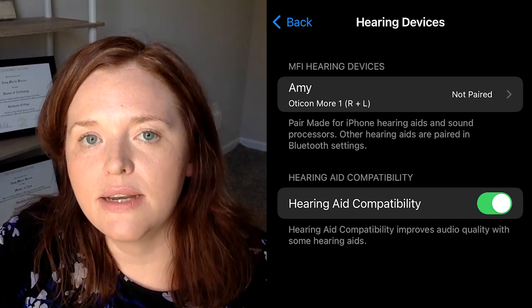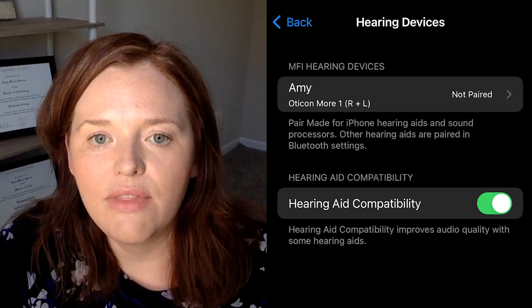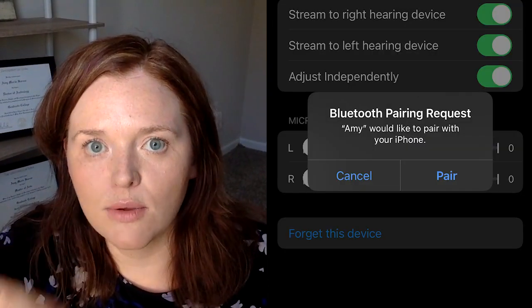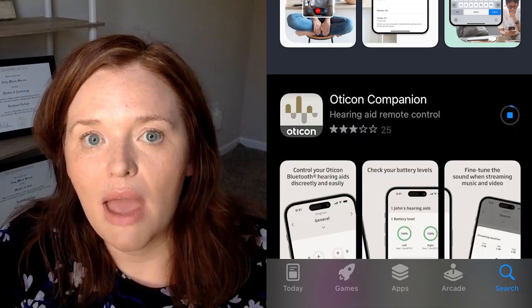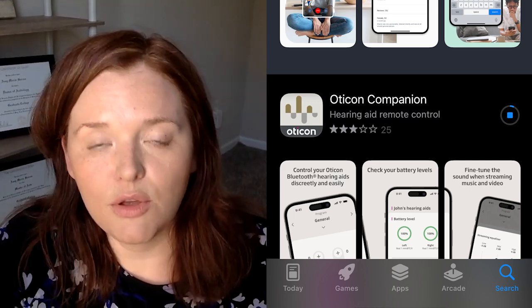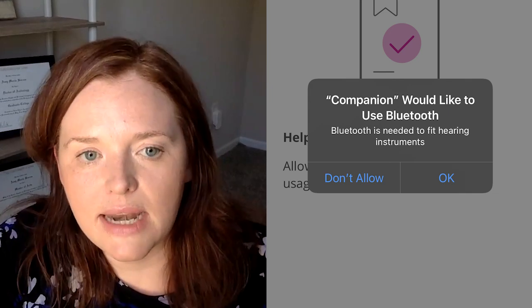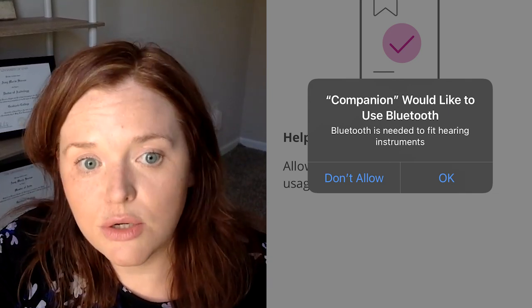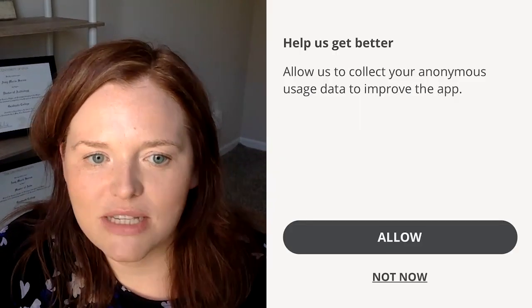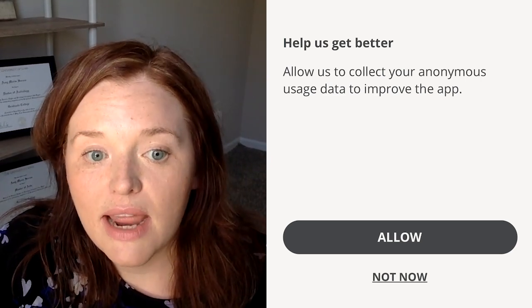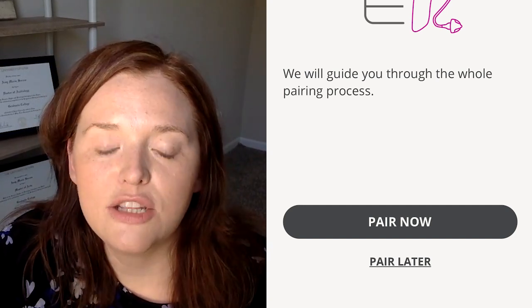You have a few minutes where the Bluetooth signal is active and it will be in that pairing mode. So you'll see them in that list there — select it, and then you should get some pairing requests. You'll get two of those — say pair and then pair. You'll want to have the Oticon Companion app, so if you haven't downloaded that in your Apple Store, go ahead and download that. Once that finishes, you can open up the app and you'll see that it's asking would you like to use Bluetooth — you'll say okay. Then you're going to see something that says 'help us get better,' so you'll say allow. On the next screen, you'll see the button that says 'pair now.' So this is where you're going to pair the hearing aids to the app. Select that and then you'll see a screen where the devices are connecting — that'll take a few seconds to finish that process.